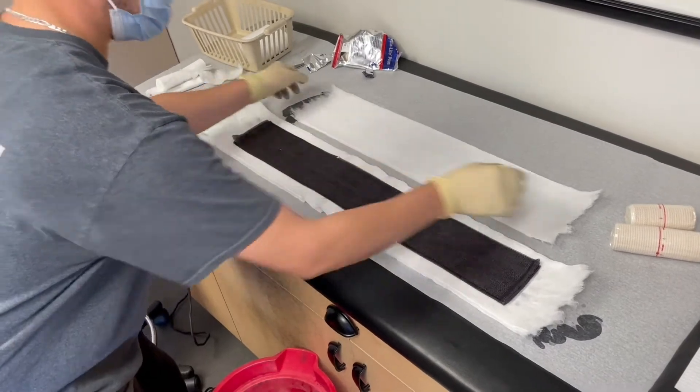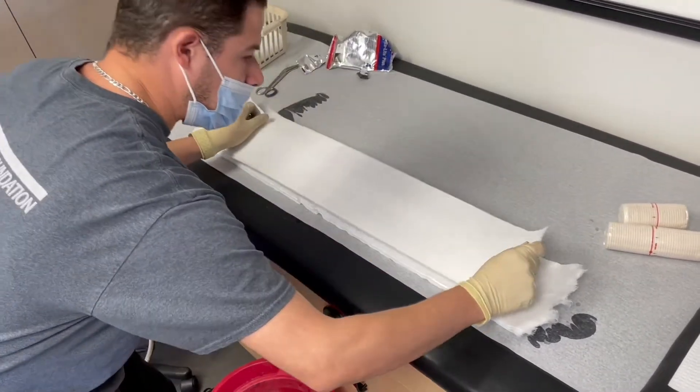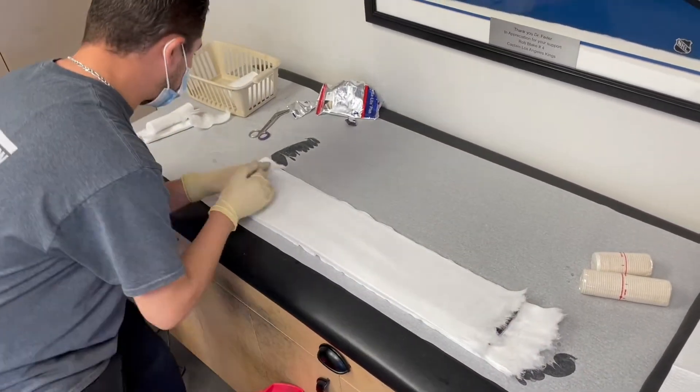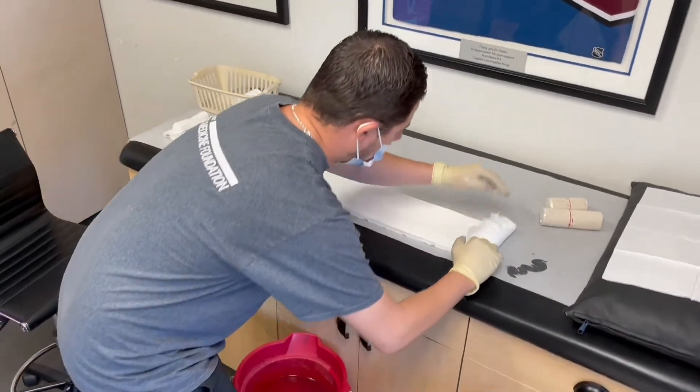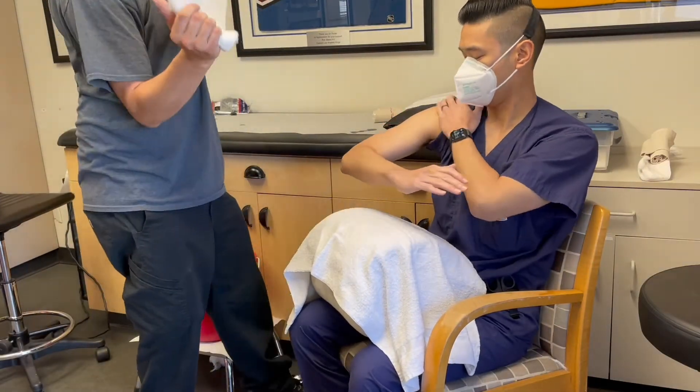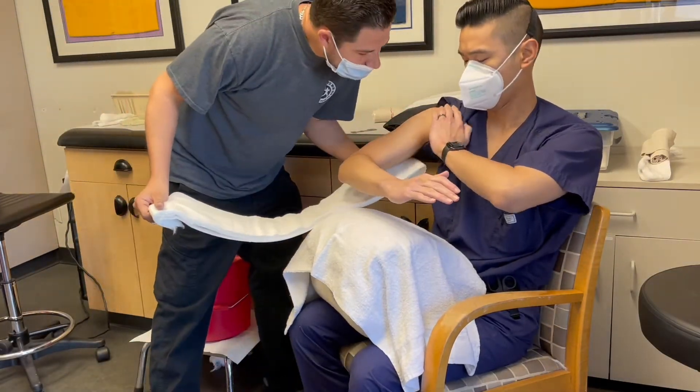We'll go ahead and laminate the splint. Now we'll apply the two or three layer padding on top of the fiberglass splint. Fold the edges over. Remember that the side with the most padding should go against the skin.